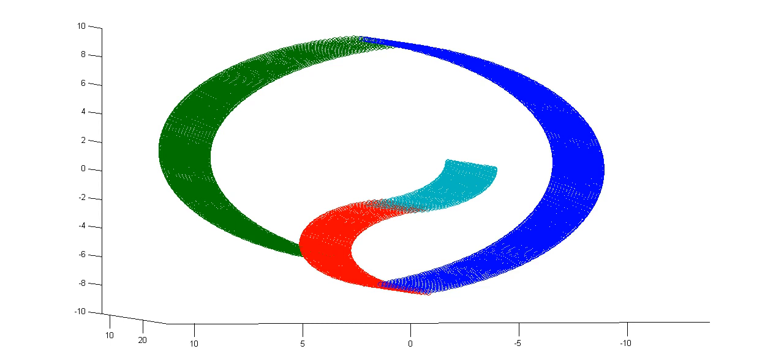If a whole bunch of neighboring voxels pass the same statistical test, then it's probably real. That's broad strokes, a very reasonable thing to do. But it's worth keeping in mind some interesting context: as a human who's actually in the scanner, you're going to move a little bit. And so there are artifacts introduced into the data collection by the person moving around.